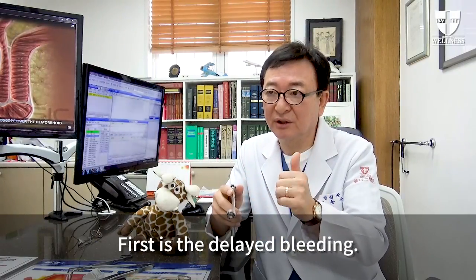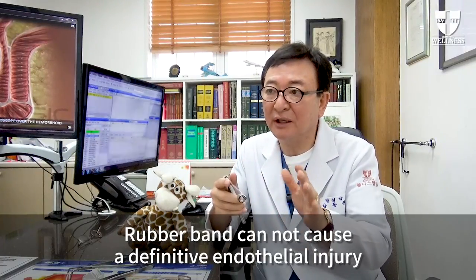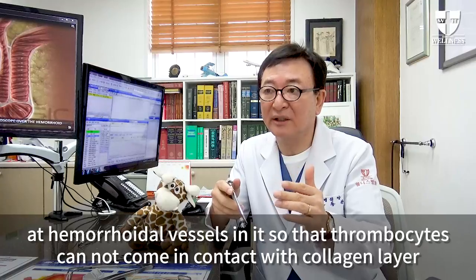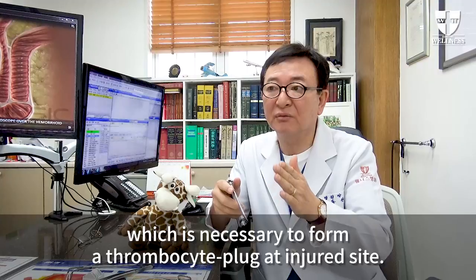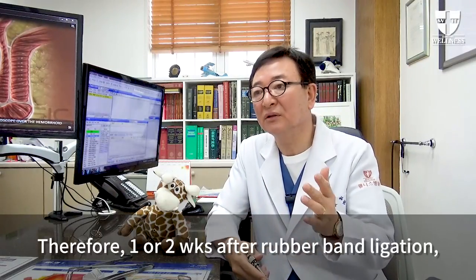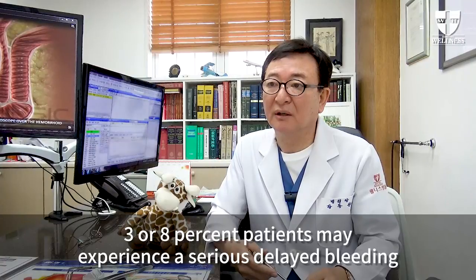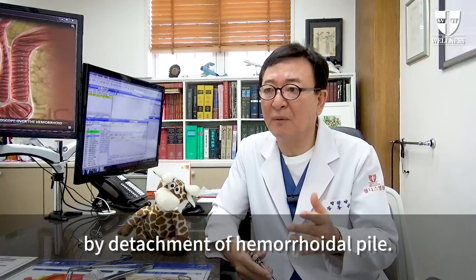First is the delayed bleeding. Rubber band cannot cause a definitive endothelial injury at hemorrhoidal vessels, so that thrombocytes cannot come in contact with the collagen layer, which is necessary to form a thrombocyte plug at the injured site. Therefore, one or two weeks after rubber band ligation, 3 to 8% of patients may experience serious delayed bleeding by detachment of hemorrhoidal pile.